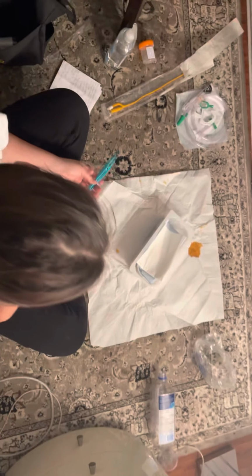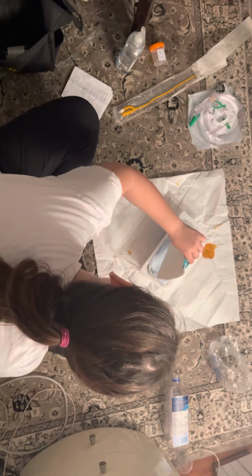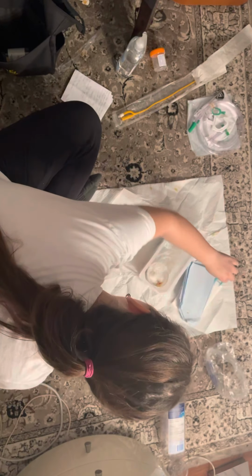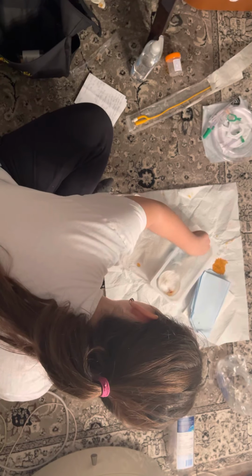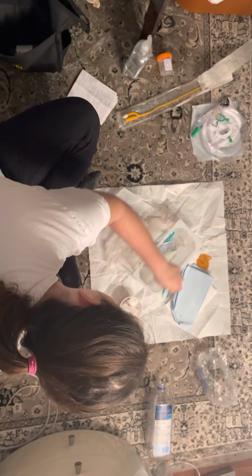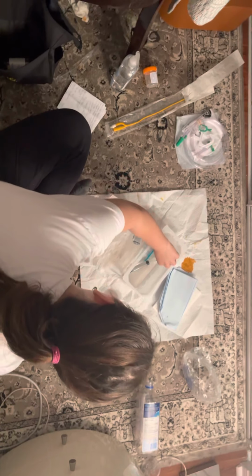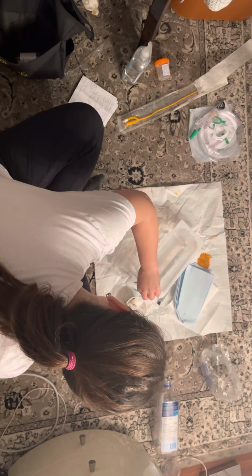Once I've done that, I'm going to begin by setting up and preparing my environment. So placing my drapes here, my sterile gloves, my cotton balls, my lubricant, my syringe, and my forceps for cleansing.